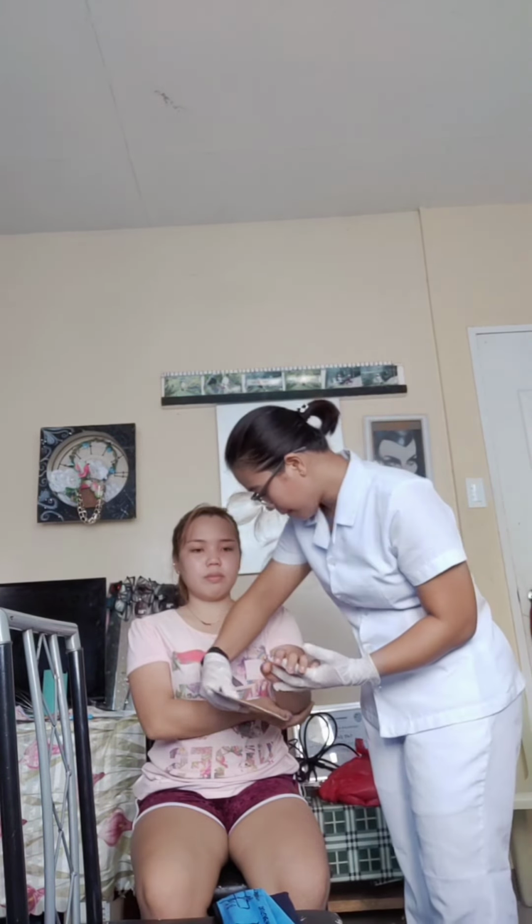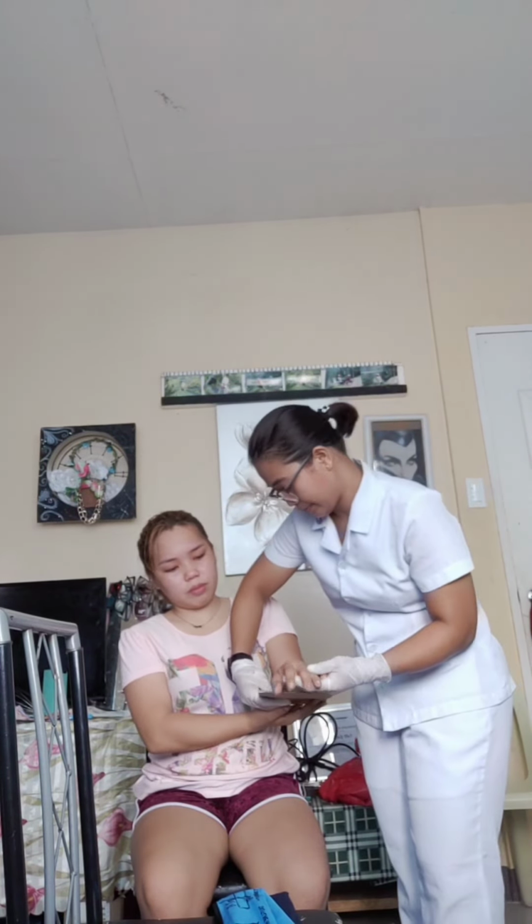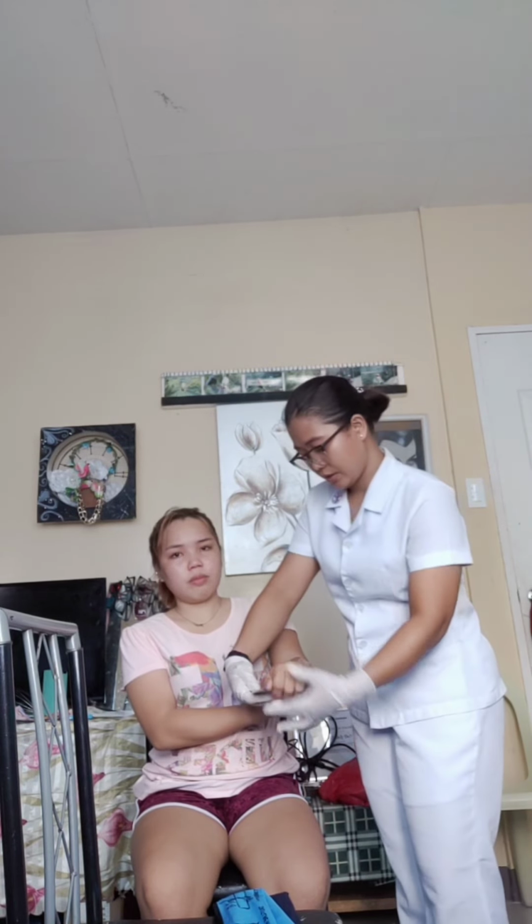After this, we will place an appropriate size rigid splint or board under the injured part. Pwede gunitan nila. After that, this is to provide the amount of immobilization to the affected area. We will secure bandages above and below the fractured area.